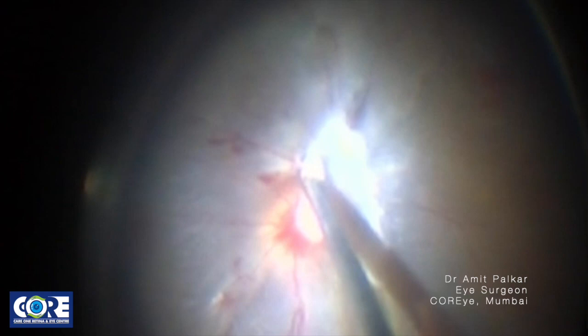and then sever the membrane there, which is going to inevitably eat up the blood vessel. It's a small ooze which is cauterized again. It's very important to clear the field whenever there is an ooze, because later in the surgery it obscures the view.